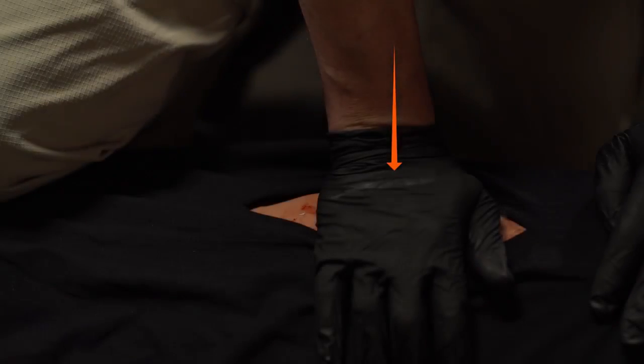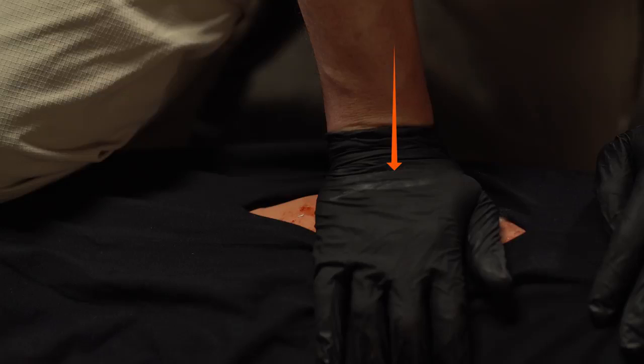Assess the wound location and severity. Apply direct pressure to the wound to prevent further blood loss.